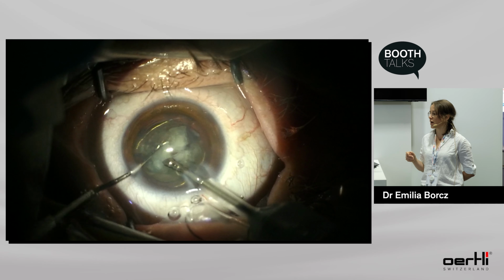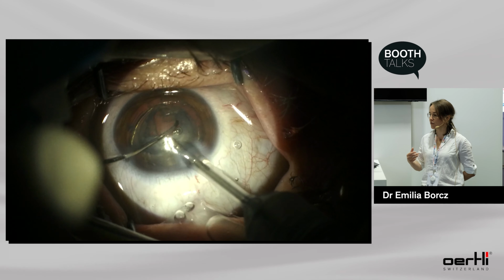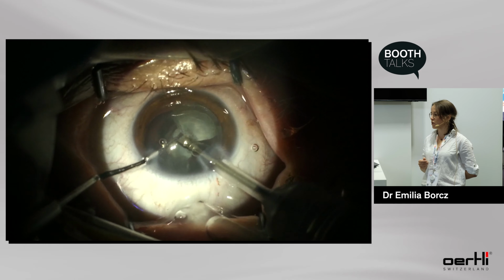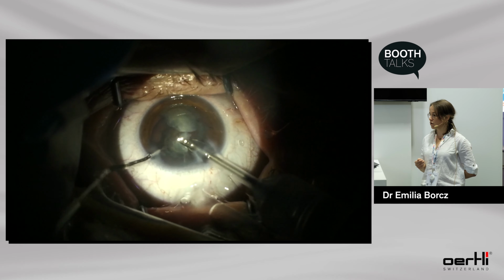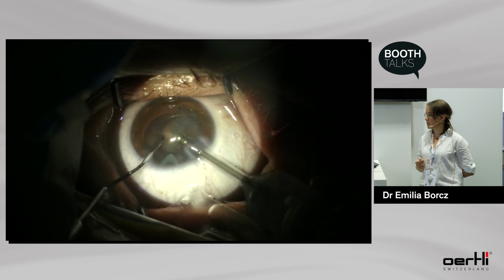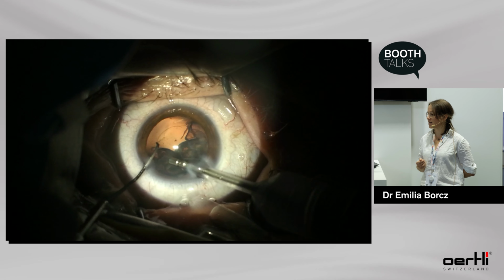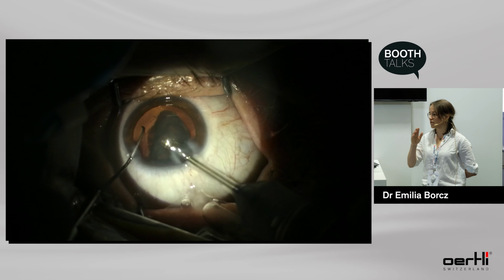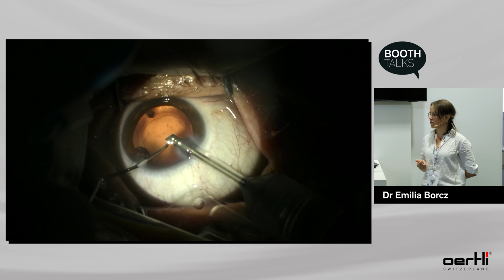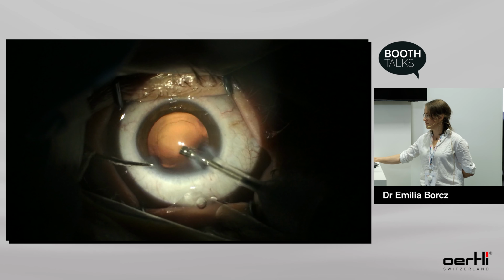I divide it into two hemispheres, and you can see how strongly it holds, so I can lift the lens. I do the maneuvers, and easily with chop I divide it into smaller parts. And the second part also goes very, very fast, with, again, bevel down. Yes, it's going very fast. I don't need to do anything, just move the foot pedal. And even the thin part of the cortex comes very easily.